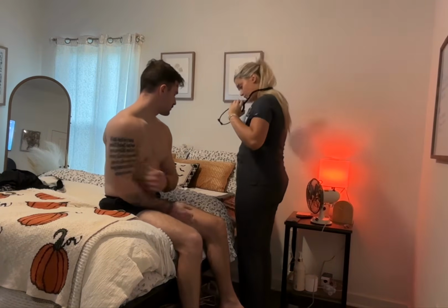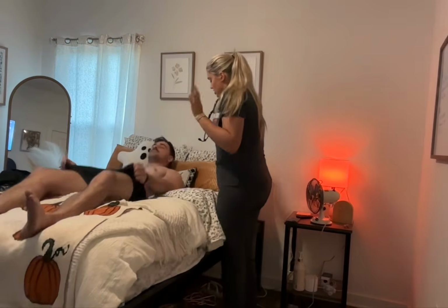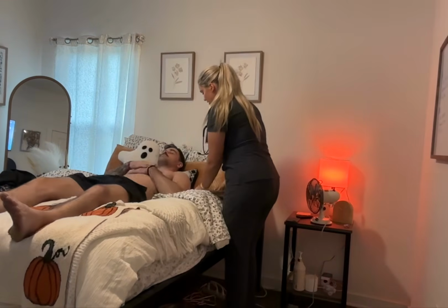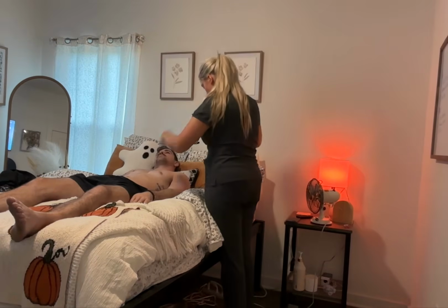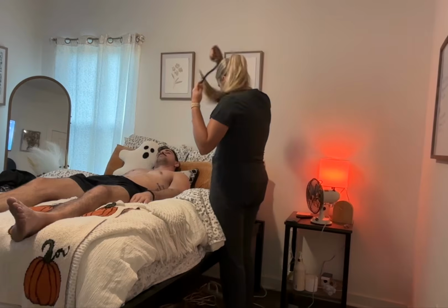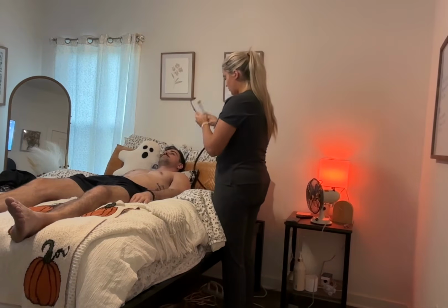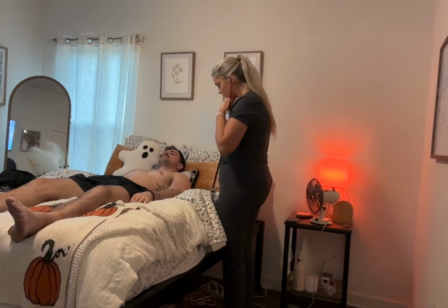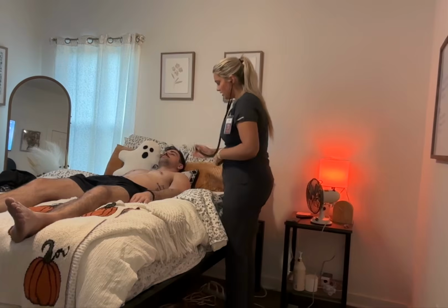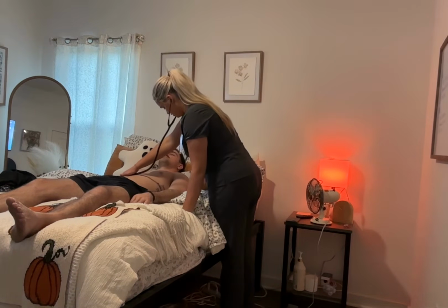So now if you'll lay back down, I am going to listen to the bowel sounds. So for this part, we're going to divide the abdomen into 4 quadrants. So we've got 1, 2, 3, 4. And we're going to start listening to the right lower quadrant. And we're listening for a gurgle, we want to make sure that there's bowel sounds in there. So listen to the right lower quadrant.